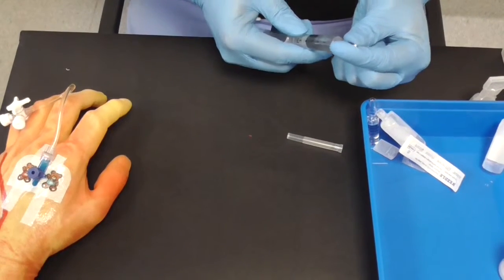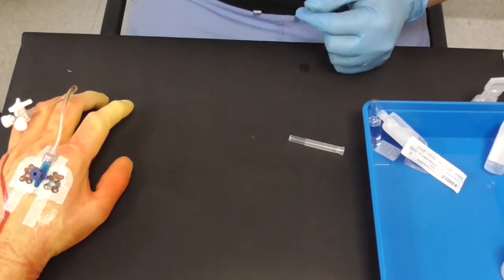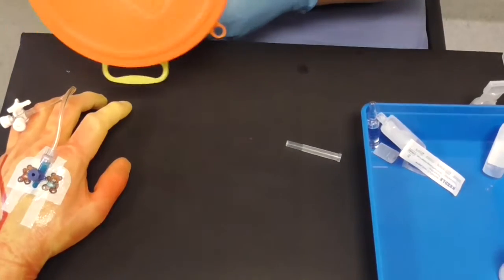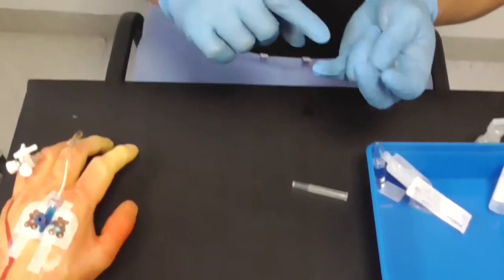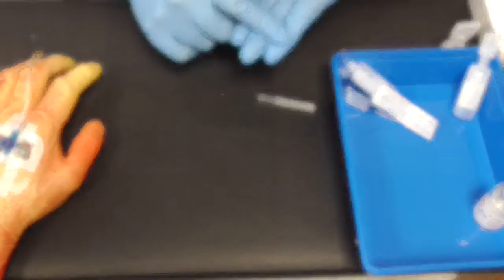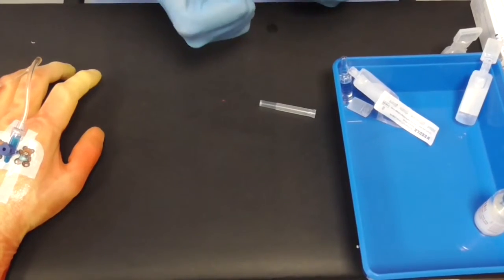Once you finish, do not resheathe the needle. You can undo it, or ideally leave it in the syringe, and then you take your trusty sharps bin and you put it into the sharps bin. This way you have safely drawn up the medication, you're giving it to the right patient, the right amount at the correct time. Ensure that they don't have any allergies while you're giving it, that you're making sure that you're doing it safely. And then you have also ensured that you've not given yourself a needle stick and you've made sure safety has been adhered to for everybody concerned. And that, the viewer, is drawing up medications in a nutshell.